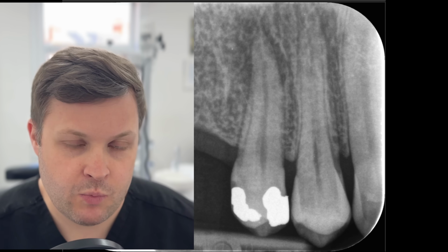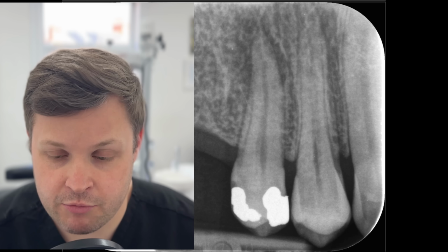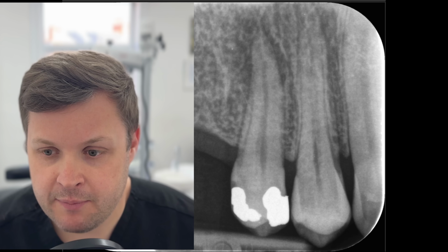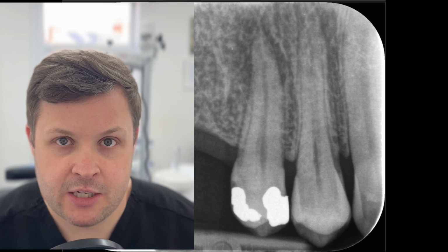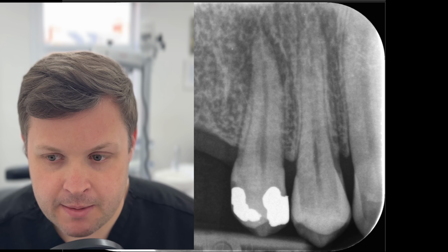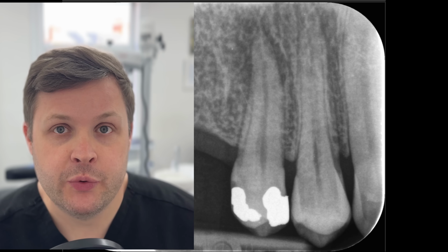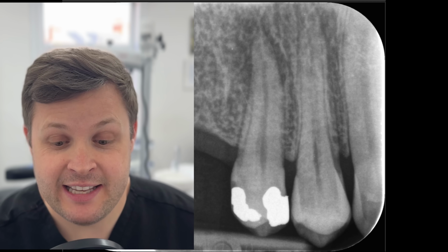A lot of the time, I've got two options here. I've got an amalgam filling, which has to be removed before I start the root canal. I could book in a half an hour appointment with this patient just to remove the filling, place a composite filling and get the patient back in. I could ask the referring dentist to place a composite filling for me, although I don't think that's a practice builder. Or I could do it all in one. But the problem, of course, is the isolation.